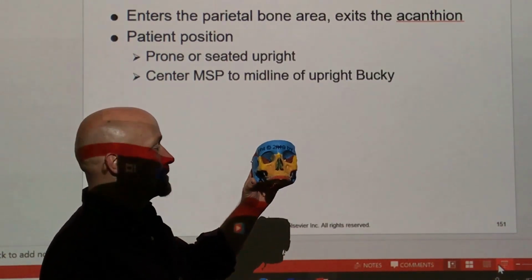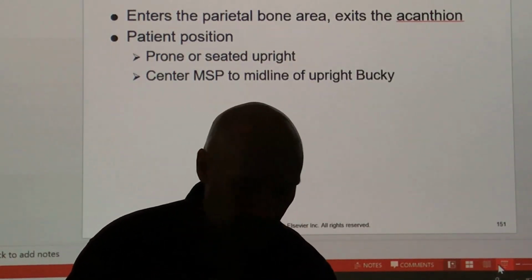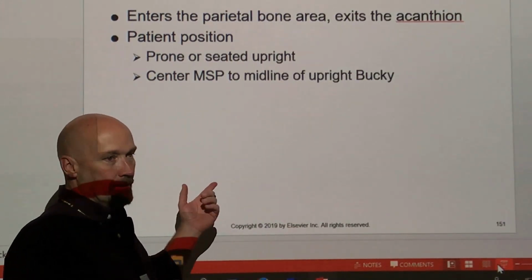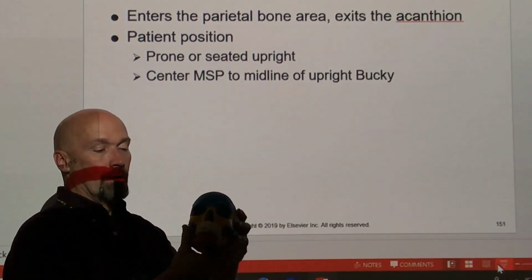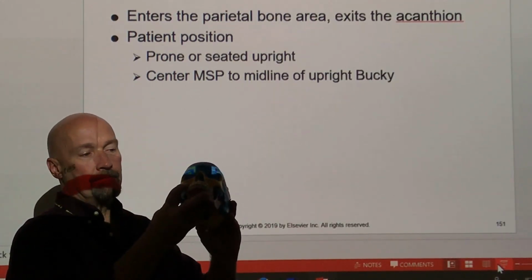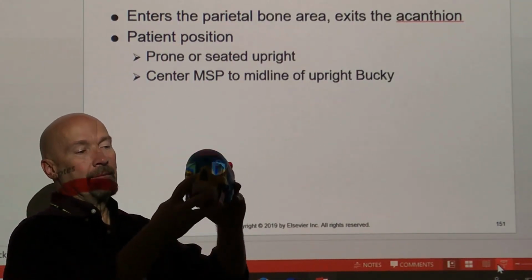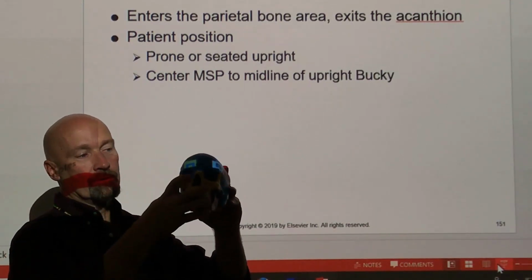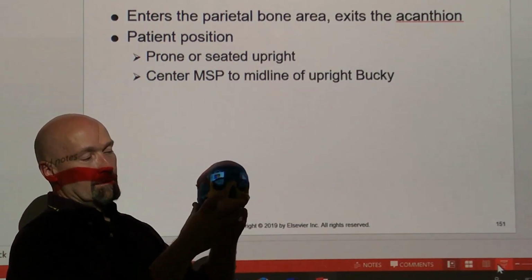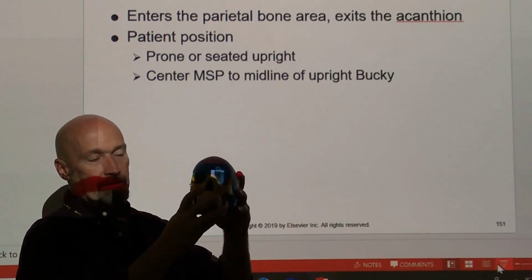A 55 Waters is really good for showing the fracture itself. So sometimes your hospital protocols will call for two Waters for orbits. One being a 37 Waters to show evidence of the blowout fracture, which will be fluid in the maxillary sinus, but also a 55 Waters, which is going to take the petrous ridges way back here and put the petrous ridges in the maxillary sinuses. 37 is going to put them below the maxillary sinus.